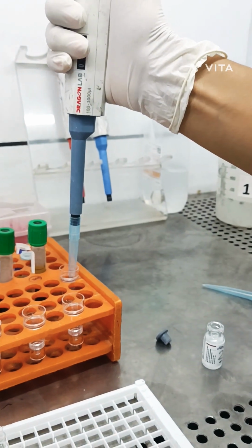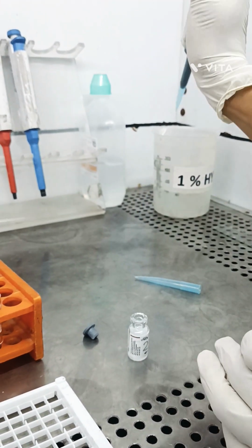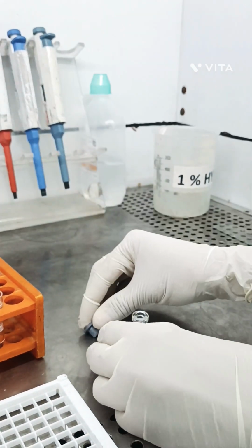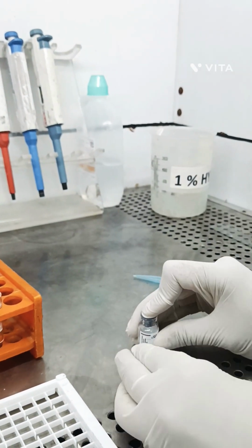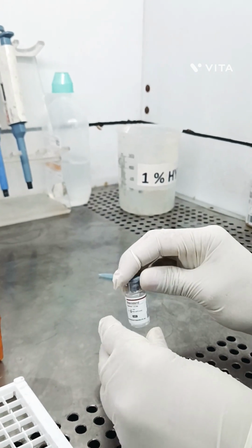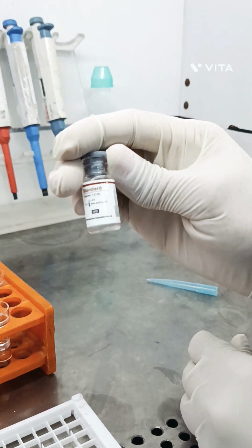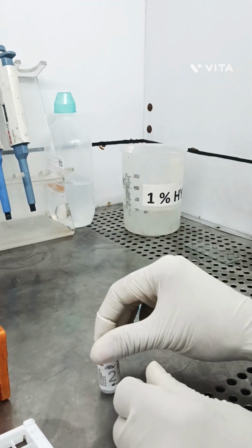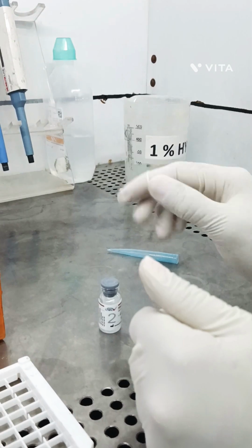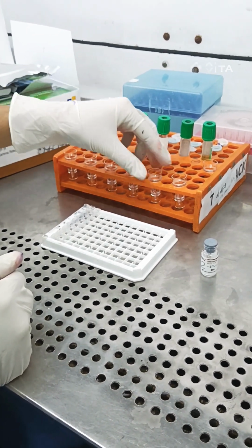After reconstitution is done, the final concentration of this standard ampule is 400 pg/ml. Mix properly, and the final concentration we have is 400 pg/ml. So the 400 pg/ml standard is prepared.